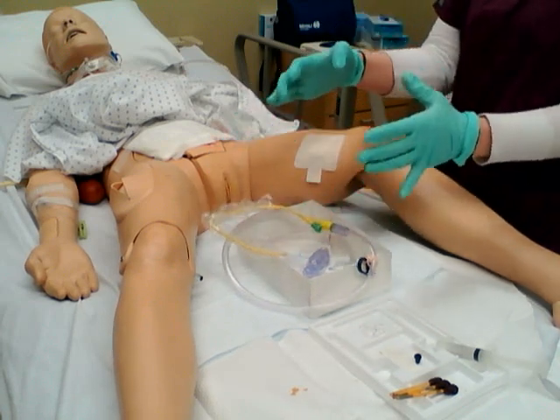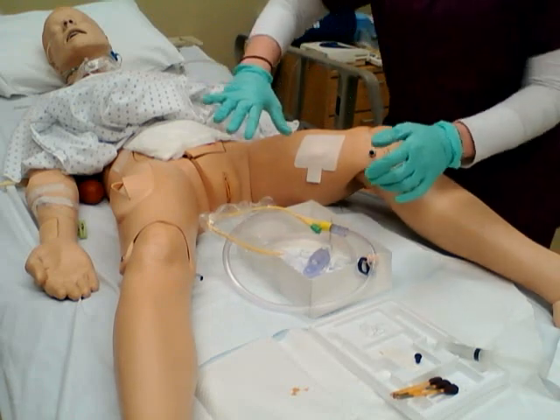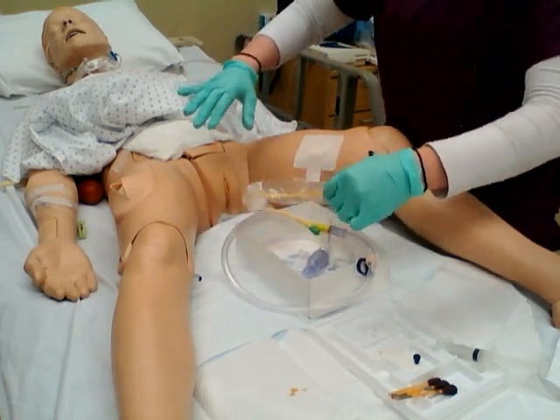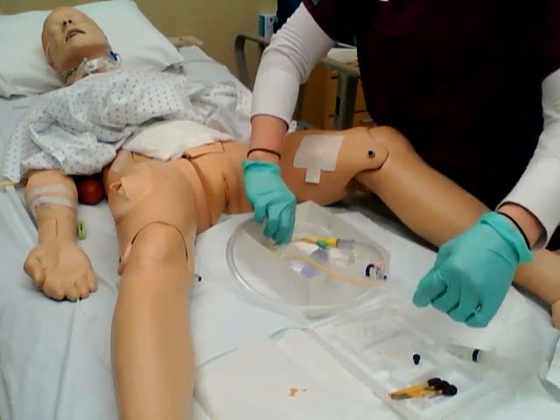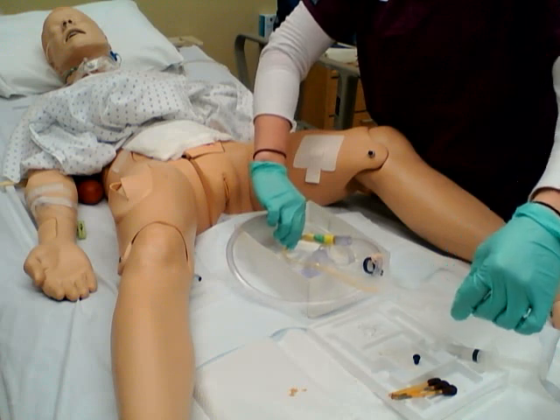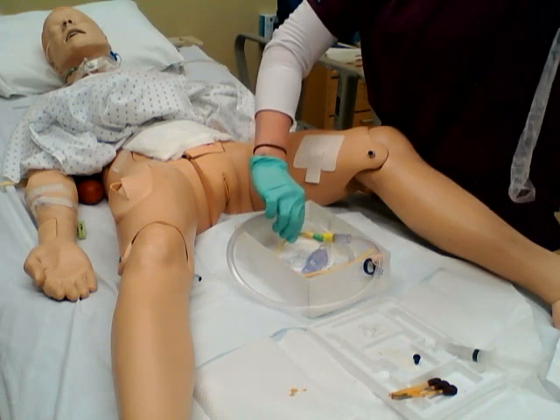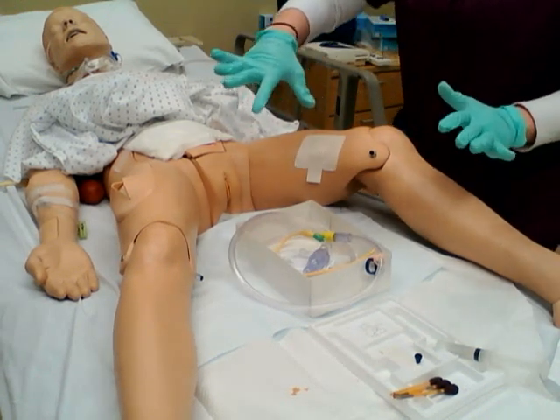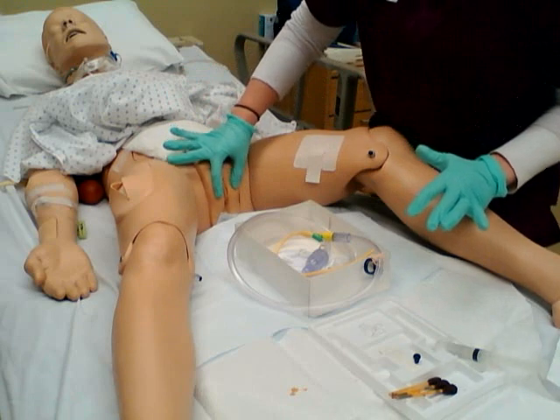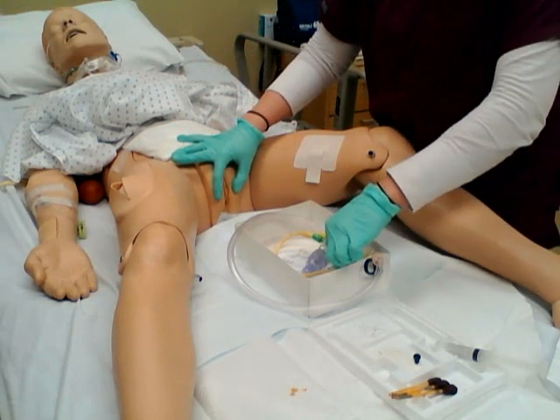So now both hands are still sterile, but this hand I am now going to contaminate. Actually, I'm going to take this plastic off here first. Actually, just gently laying that end into lubricant, maybe. Okay, with this hand now I'm going to pull this apart so that the catheter can be inserted correctly.